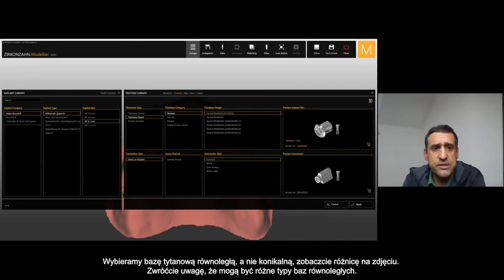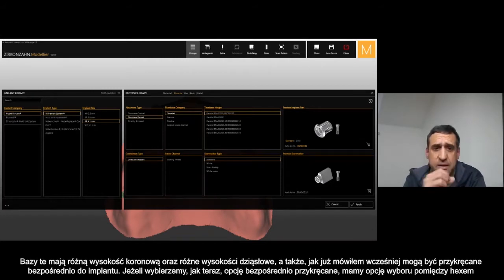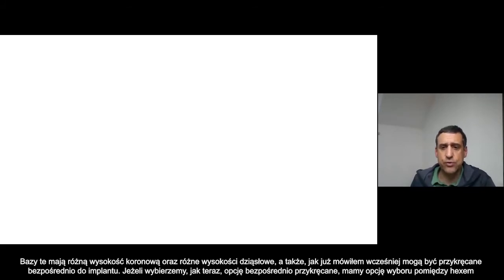Here you can see, for the sample, we selected titanium base parallel — not the conical one but the parallel one — and you have different kinds of parallel T-bases with different heights. The shoulder is at different heights of the T-base.